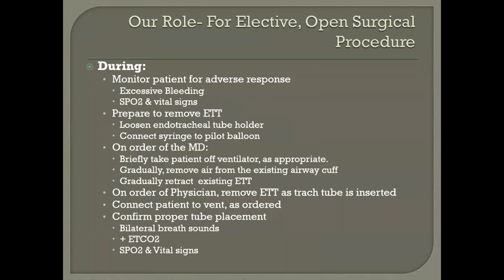It doesn't mean these patients, and we did trach eventually a lot of COVID patients, but today we're taking precautions that we otherwise didn't take. So when I'm assisting with a tracheostomy or extubating a patient, I will disconnect them at the ventilator, the proximal end, the vent outlet, just as I'm ready to extubate them, or just as I'm ready to facilitate the removal of the tube so that the trach tube can be put in place. That way you're not spraying secretions at the distal end.